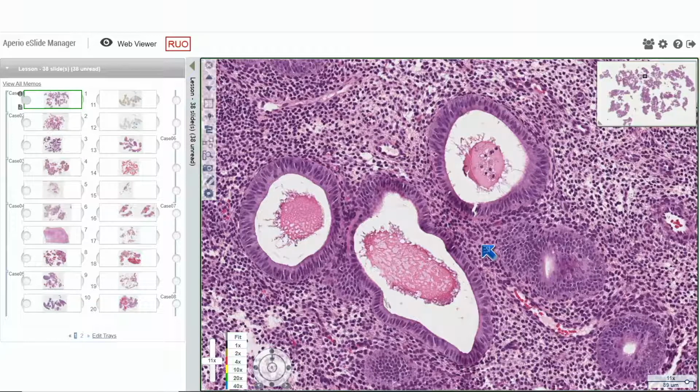And one thing to keep in mind is that even though we think about disordered proliferative as showing mitoses, it depends on what the estrogen level is at that time. So the estrogen can affect the endometrium, cause it to proliferate and form cystic glands, but then if the estrogen levels decline, you may not see mitoses, but it still shows that it has that background of too much estrogen effect on the endometrium. And this can be due to the stuttering effects of estrogen around the perimenopausal period.